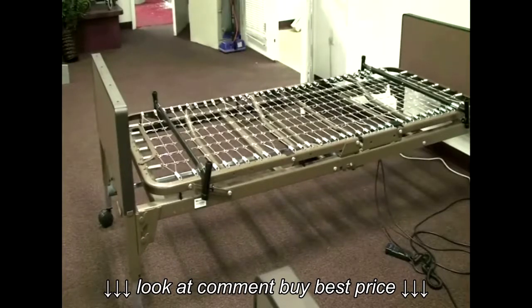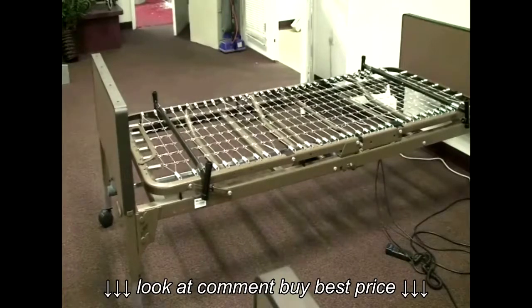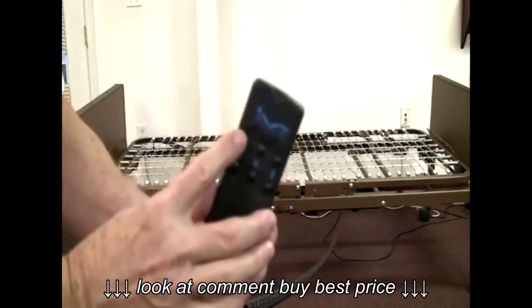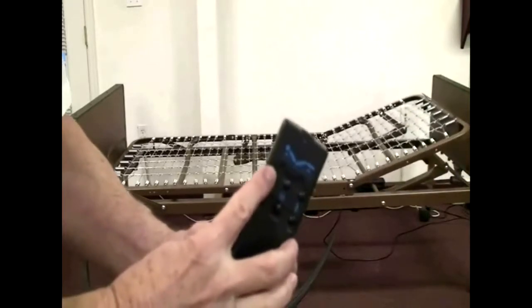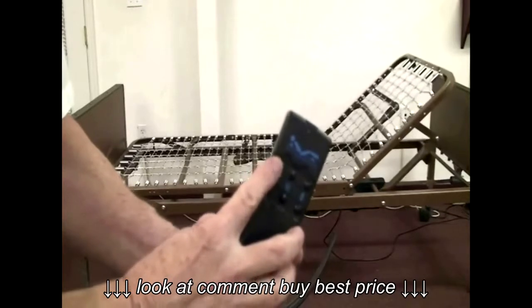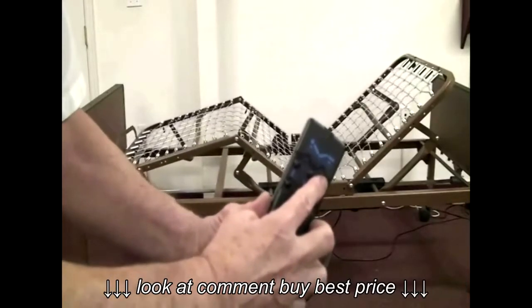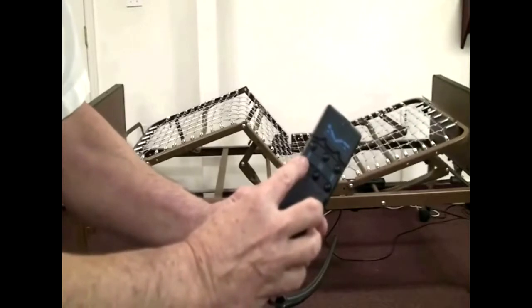We'll look at the operation, unboxing, assembly, and some troubleshooting hints. Let's take a look at how the hand control or hand pendant works. If you press the top button underneath the picture of the head section, the head section will go up. If you press the top button underneath the picture of the foot section, the foot section will go up. If you press the bottom button under the picture of the head section, the head section will go down.